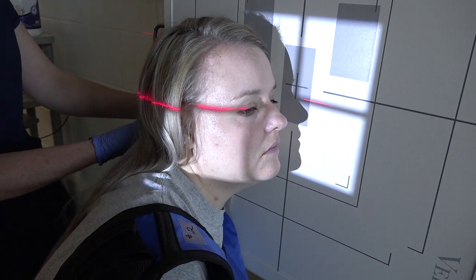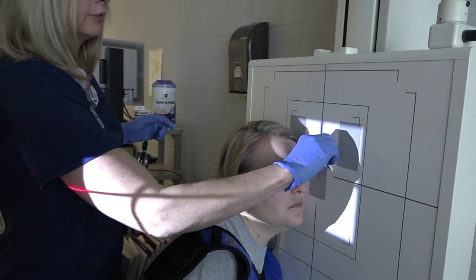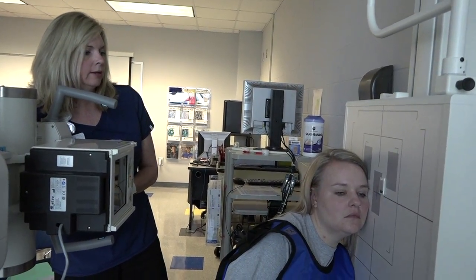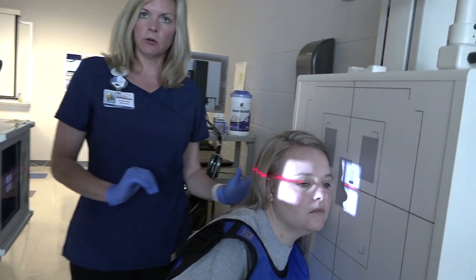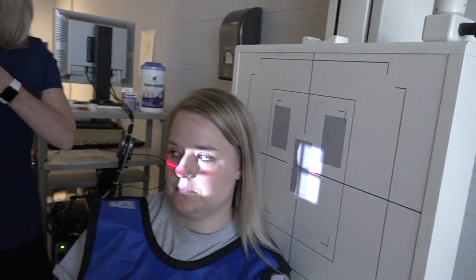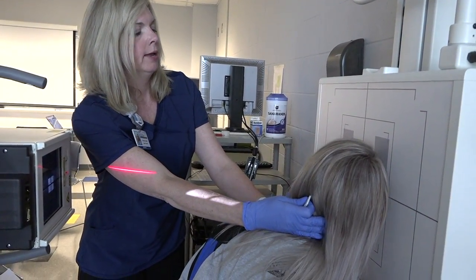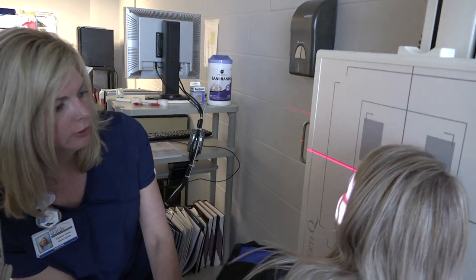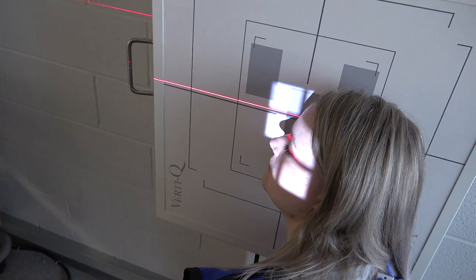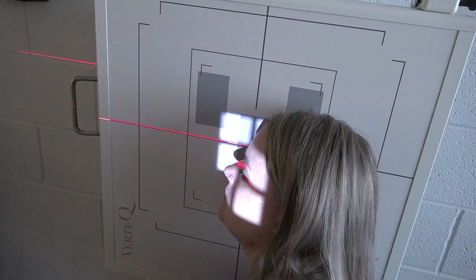We're going to line up the tube and bucky. We always do both sides for comparison, and we can collimate a good bit since we're just focusing on the nasal bones. This is our left side, so now Melanie will turn around to the other side. We'll move her shoulder and head into position, scooting back just a tad, with the laser at half an inch below the nasion.